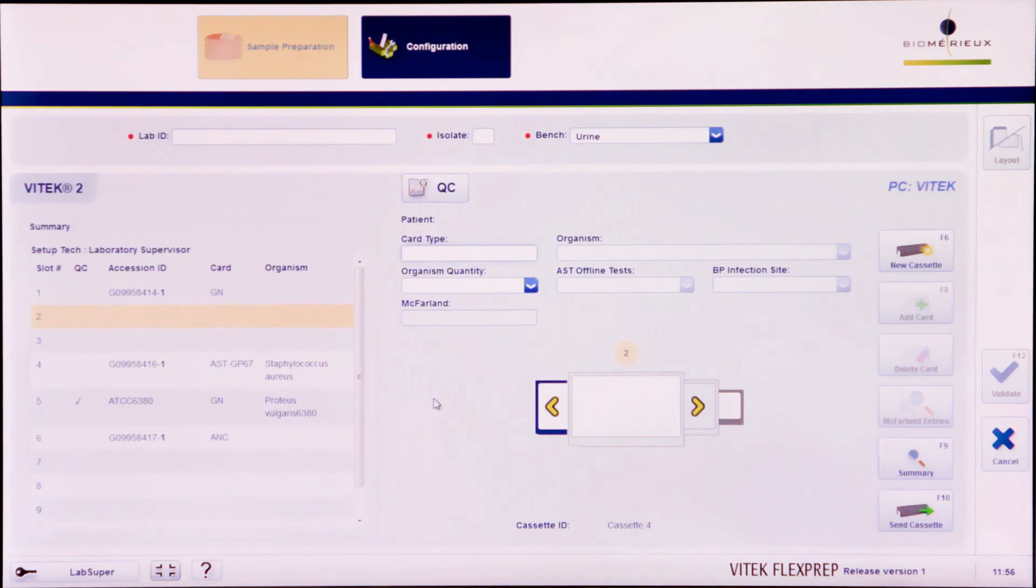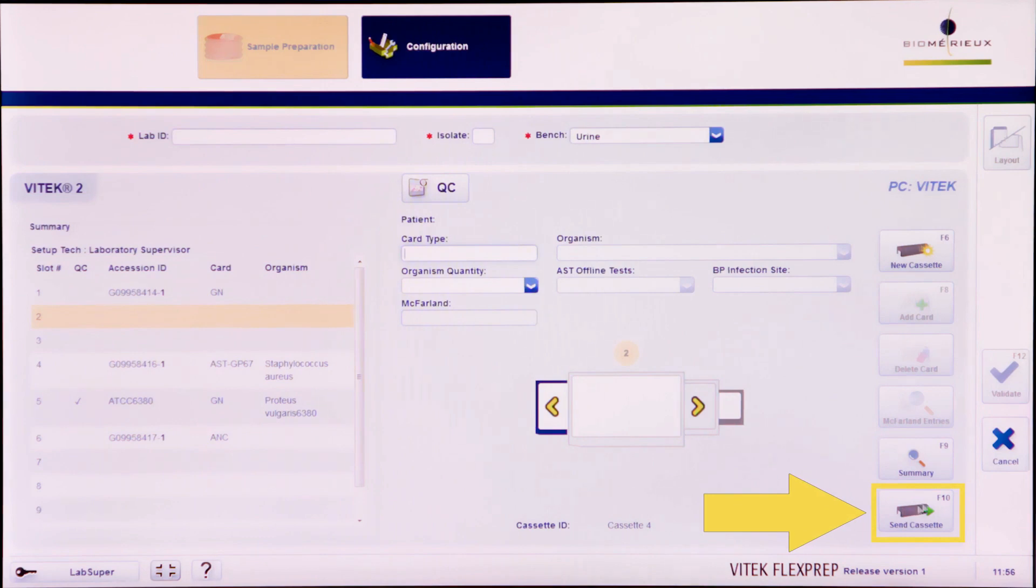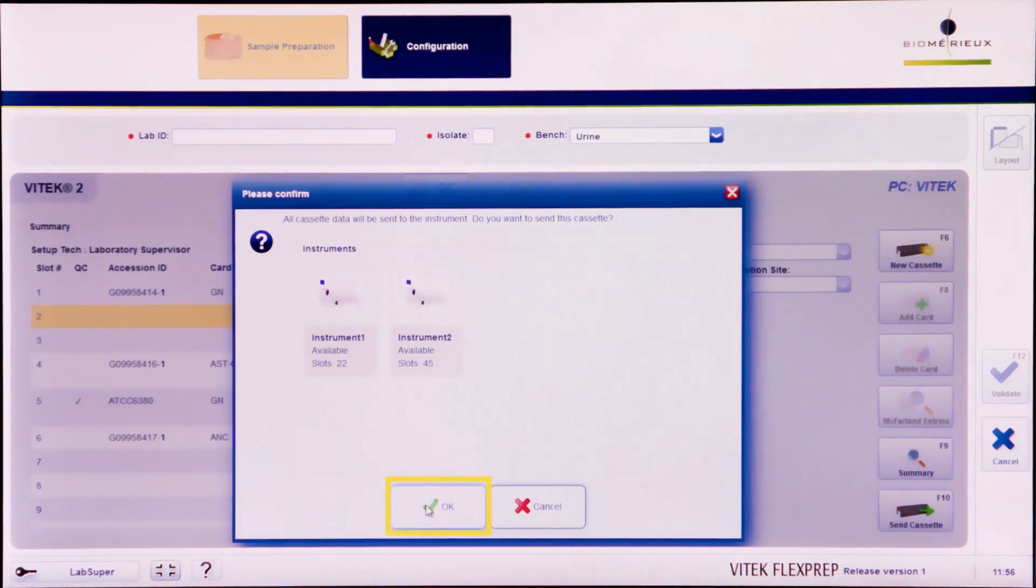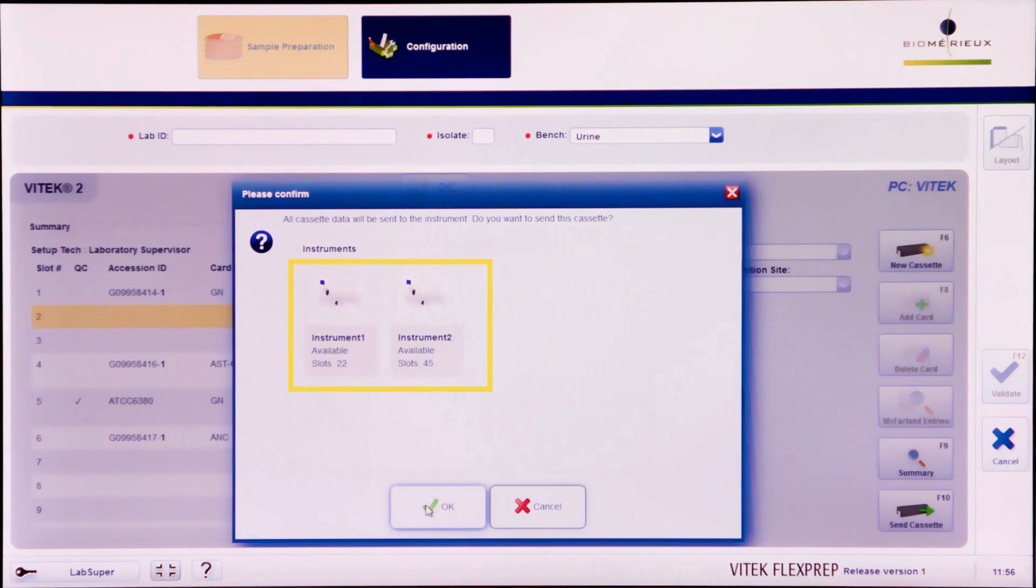Upon completion of a cassette, click the Send Cassette icon or press F10 to send the cassette to the Vitek 2 PC. A confirmation dialog box will appear. Select OK to send the cassette. The definition will be sent to all of the listed instruments.